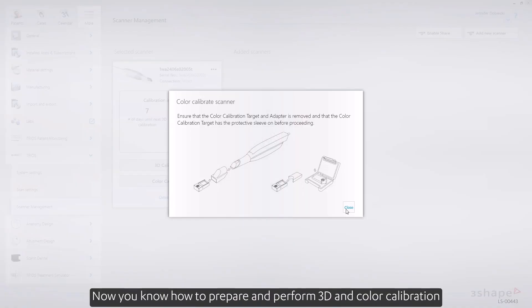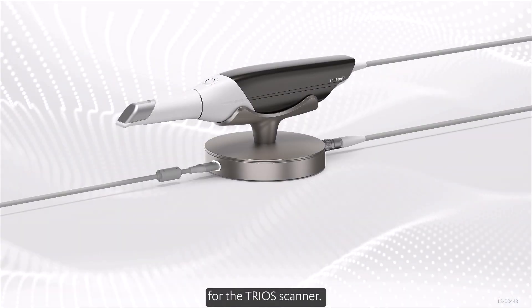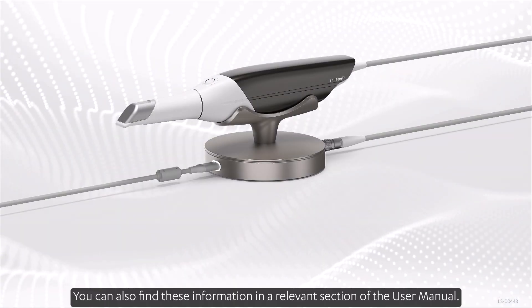Now you know how to prepare and perform 3D and color calibration for the TRIOS scanner. You can also find this information in a relevant section of the user manual.